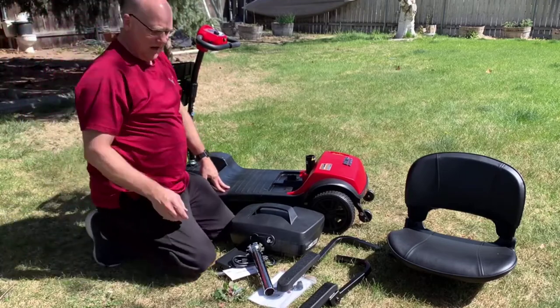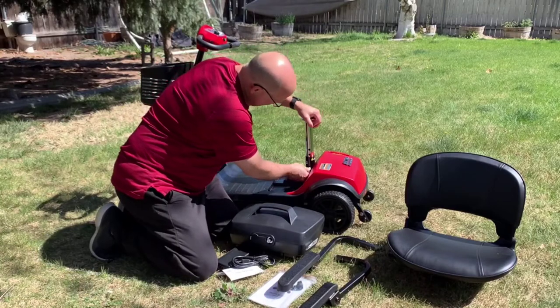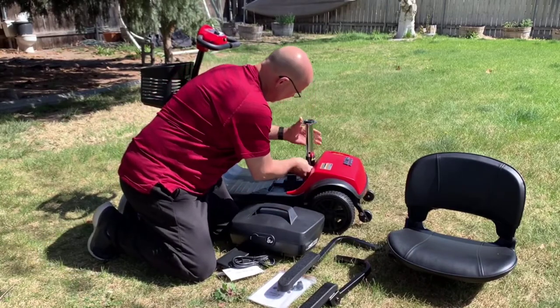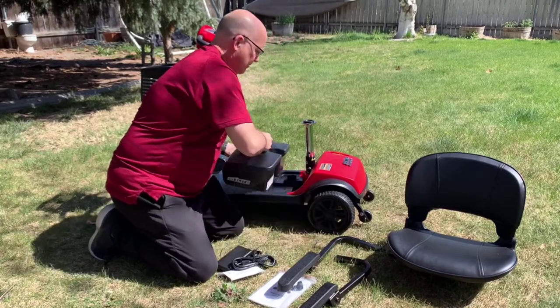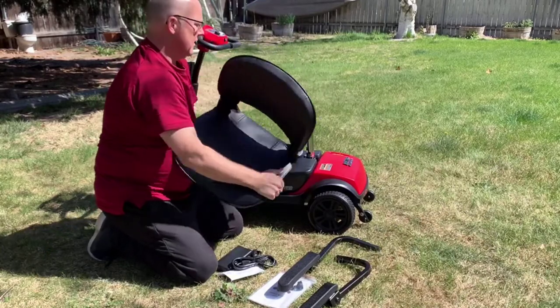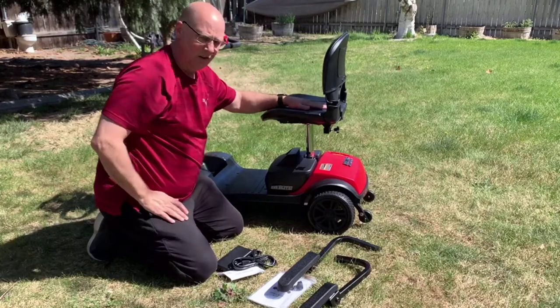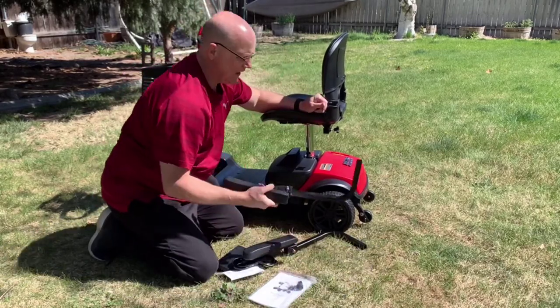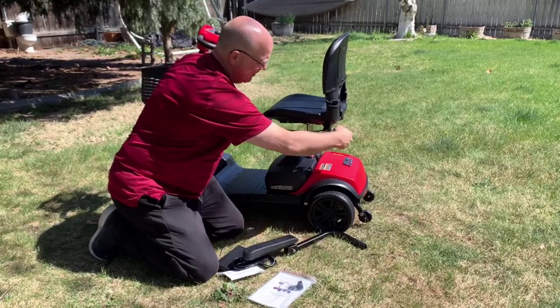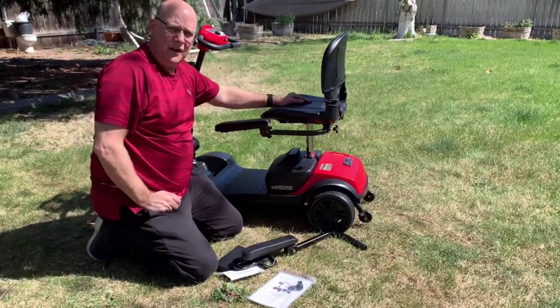Once the basket's on, you have your seat pole — put that in and lock it into place. We can put the battery on. Once you have that nice and solid, you can install the protected arms. They slide in right here, then you can lock them into place, and put the other one on. That's how quick it takes to assemble this.